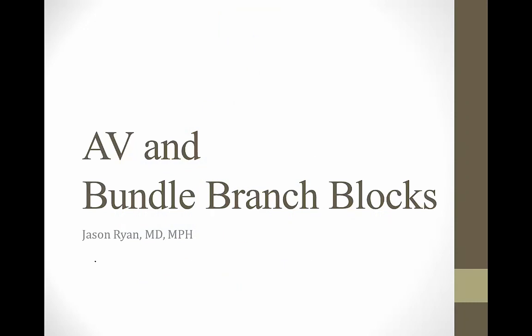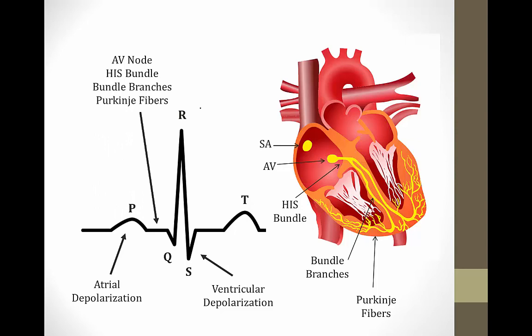Hello everyone and welcome to our module on AV and bundle branch blocks. Let's begin by reviewing the path of electrical impulse conduction through the heart.